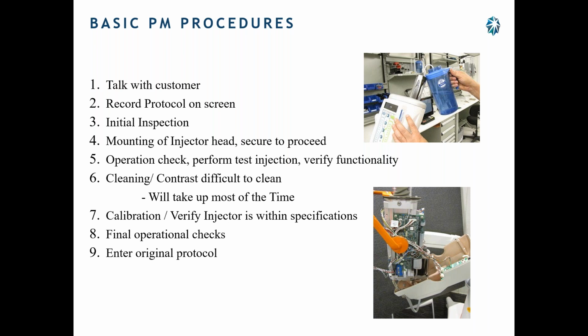Oh my God, it's broken. Really? I've seen that. Initial inspection. What's broken, what's not? Is it in good condition? How bad is the contrast on it? Mounting of injector. Yes, they have fallen from the ceiling. Operations check, perform test injection, verify functionality.